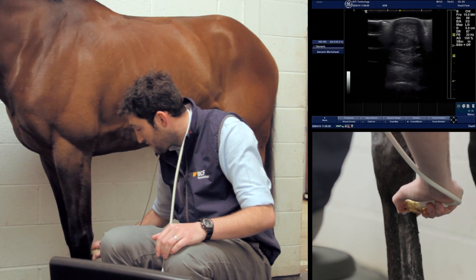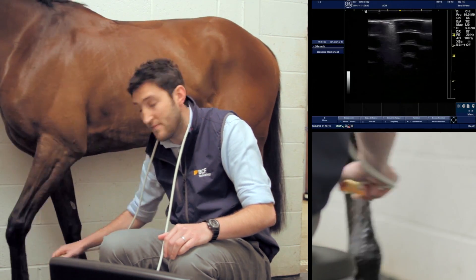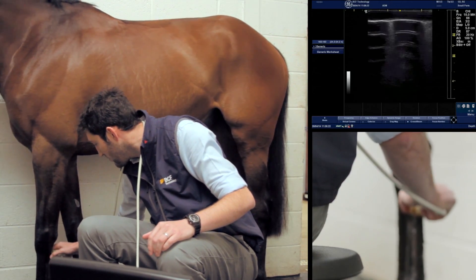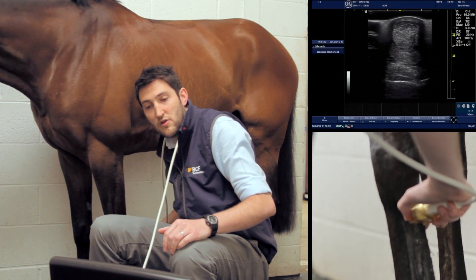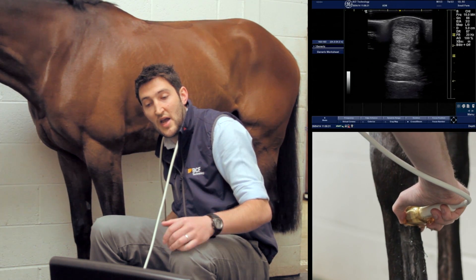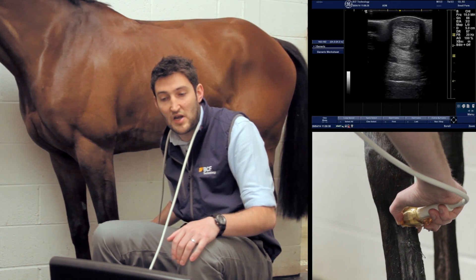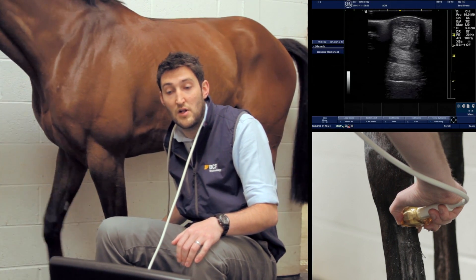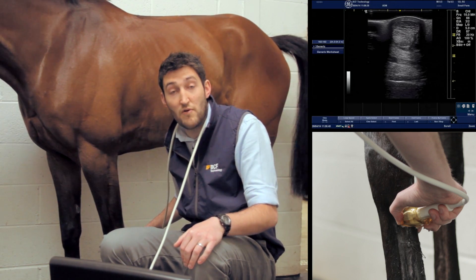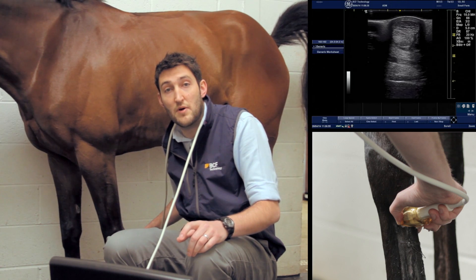Now dropping down about another three centimeters into zone 1b, approximately four to seven centimeters distal to the accessory carpal bone. Much the same structures are visible. Freezing the image, the structures look very similar to zone 1a, but we're just starting to lose the remnants of the flexor retinaculum around the superficial digital flexor tendon.